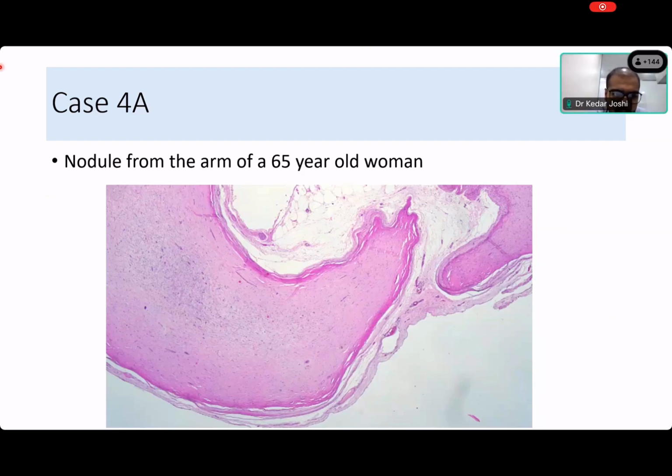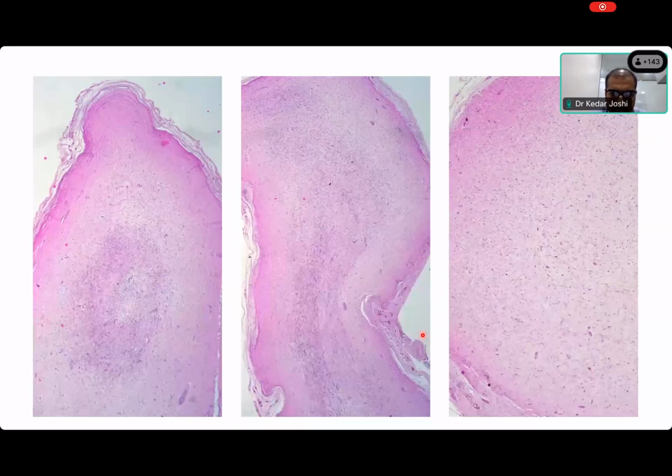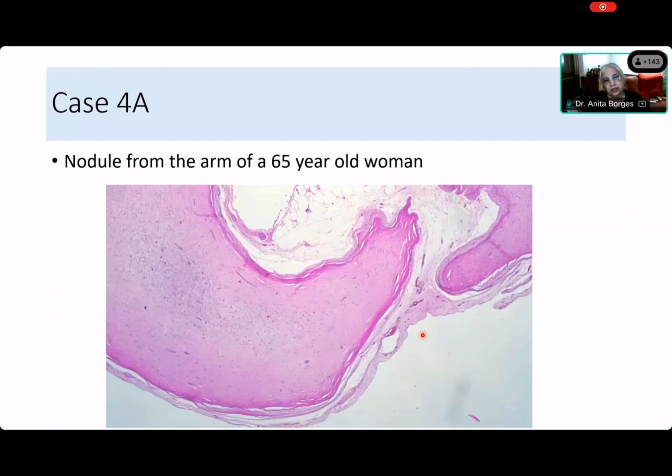In this picture, the section under study shows a well-encapsulated lesion. The subcapsular tissue appears to be homogeneous at this location. And surrounding the capsule, some connective tissue is seen. What kind of connective tissue? It appears to be fat and collagen, ma'am. Fat and collagen. That is this. But what is around this thing? Kedar? You said that this is well encapsulated.